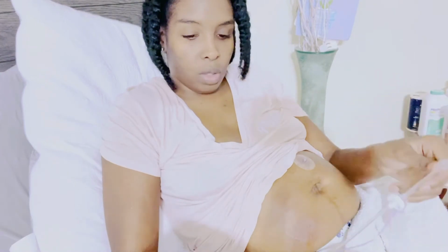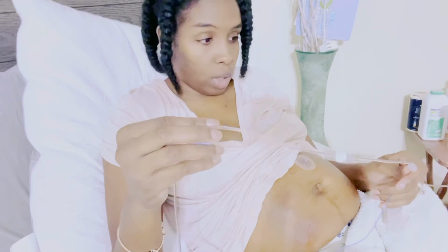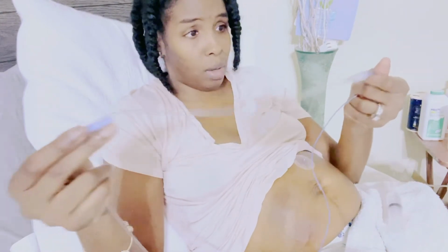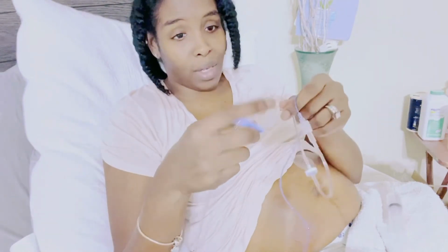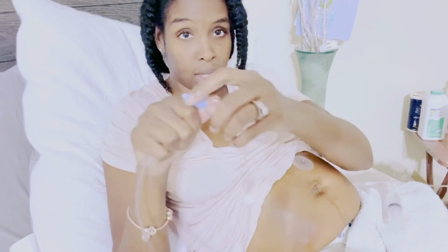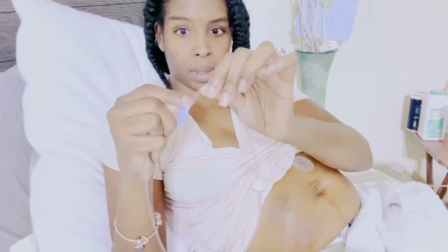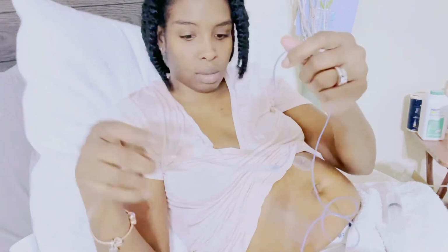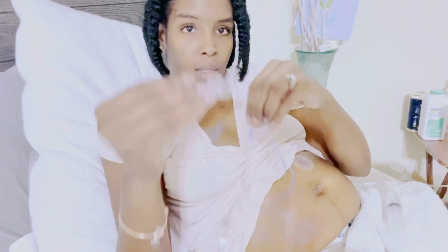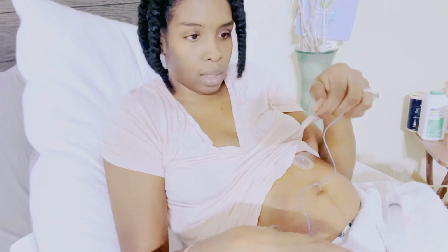And now when you're doing this process, you can clamp your tubing, but I'm so fast with it and no medicine has been lost, so I don't even clamp this. But you can clamp this to make sure your medicine doesn't leak. So clamping this is like that, but I don't ever clamp it because I don't have time for that. It's not that serious for me. So now I usually hold this over the little plastic area to make sure I don't make a little bit of a mess.